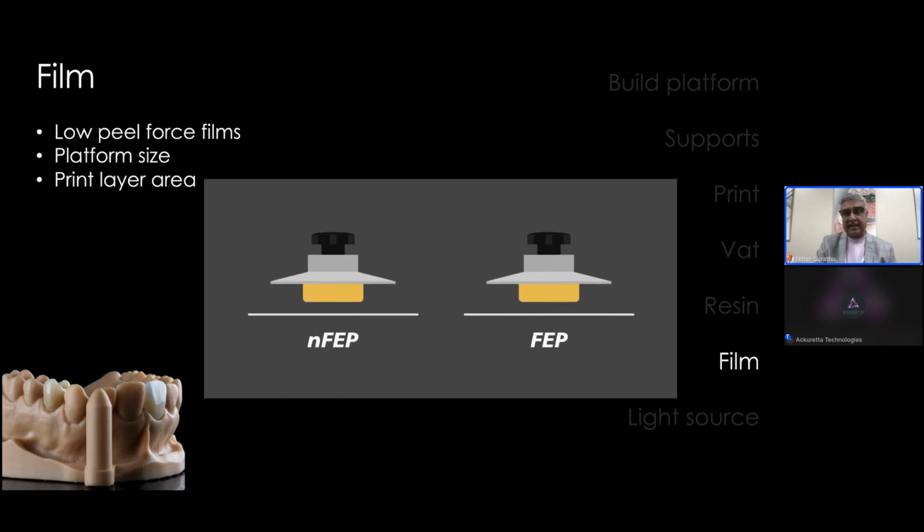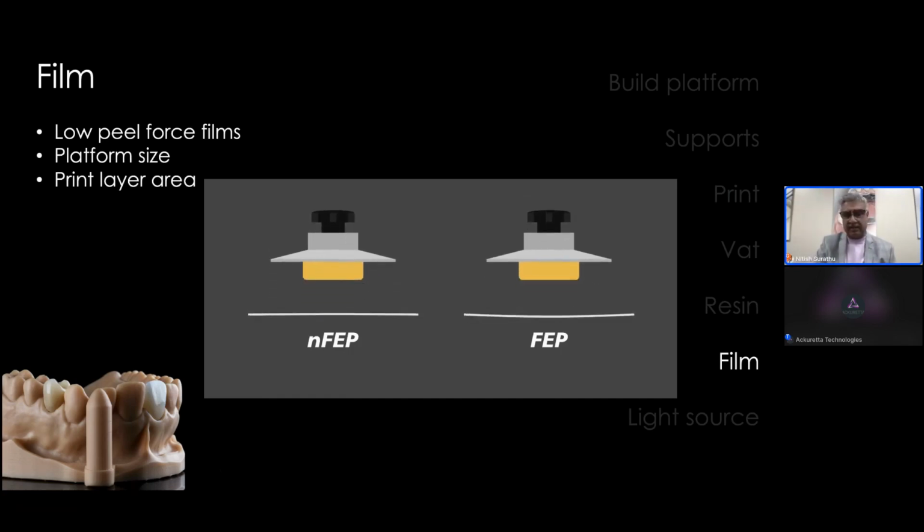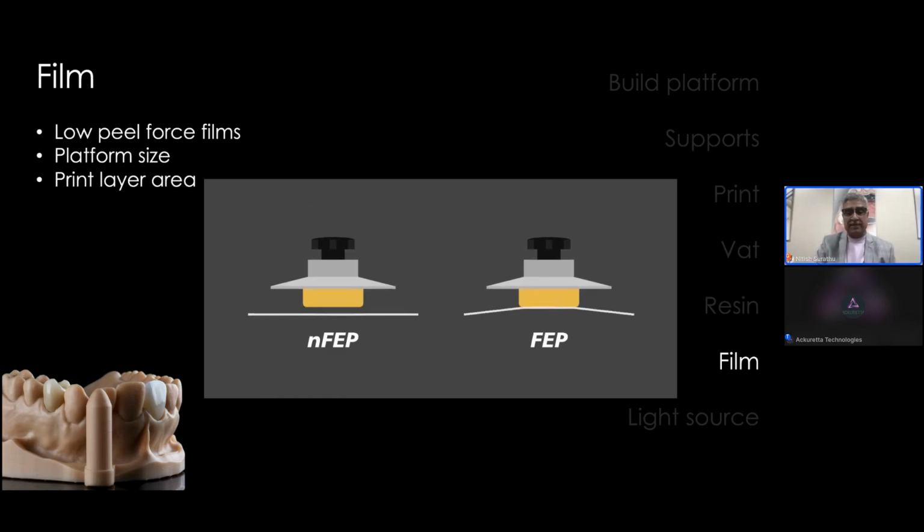Platform size is directly relevant to peel force. We talked about that, and we talked about print layer area as well, so I'm not going to go into that again.